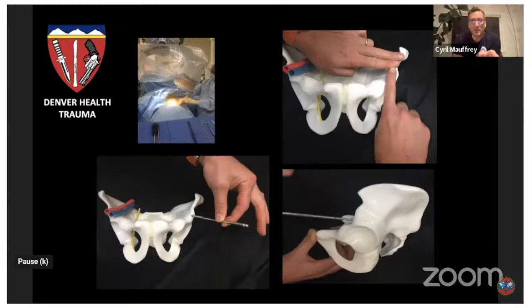You can see me struggling here on the top left picture that you have your hands and the wire and the X-ray right in the way. So I don't use it. The first view that I use is an iliac oblique. It's like using a lateral view for a retrograde femoral nail. If you're on the bone on that lateral view, you are on the bone. You're right on the AIIS.